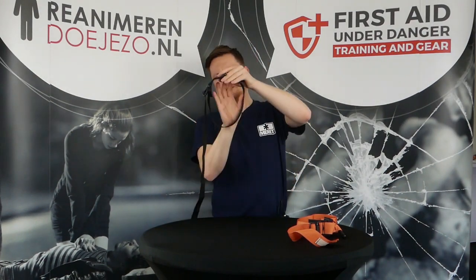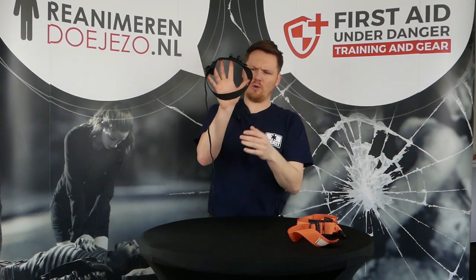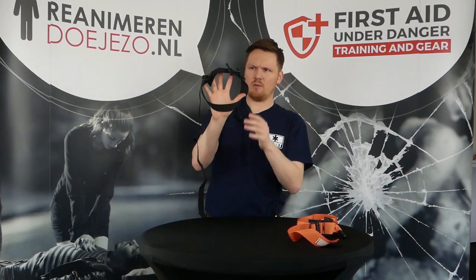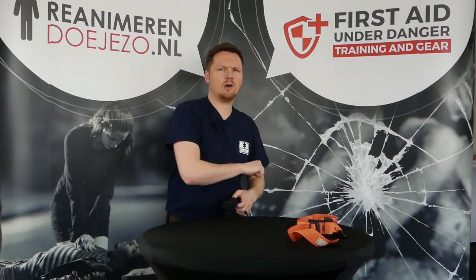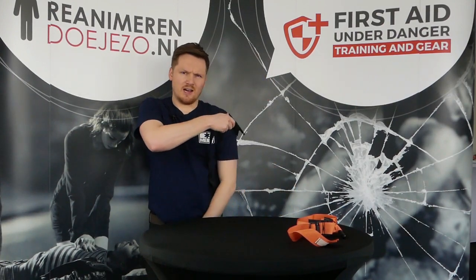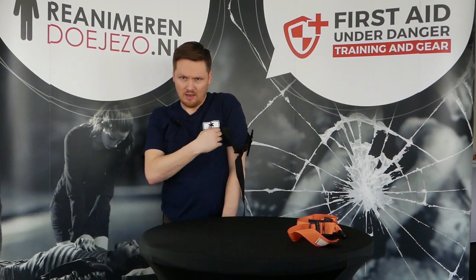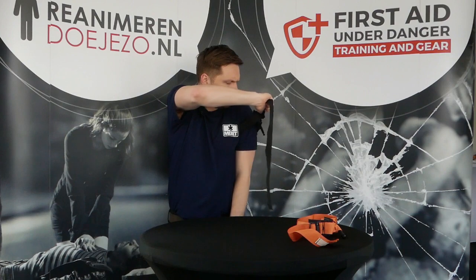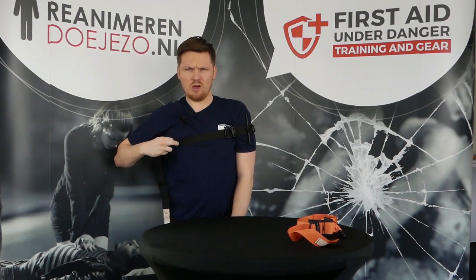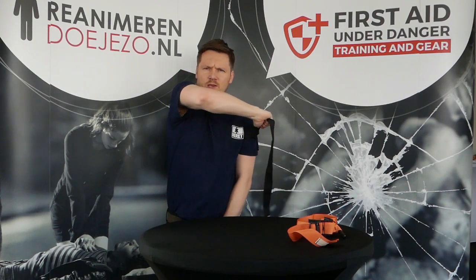What I just did is make it a little bit smaller, so it's not even really the width of my hand, because I'm now not using this part anymore, to see if I can pull it tight in one go. So you need to place it as high as you can, so it is important that you can keep it there. So that's one thing you need to do, and then, because you have one go, don't let it go, walk back to your tourniquet and do the same thing again.